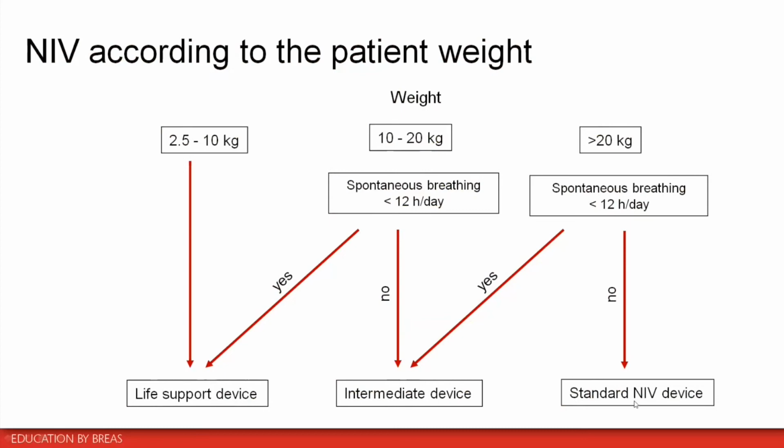As I remember, an NIV device usually detects the patient above more or less 13 kilograms, but if you want to be sure that you have a correct detection, you can go either with patients over like 15 kilograms or over 20 kilograms if you want to feel more comfortable. What is important is that you have checked that the patient is correctly detected.